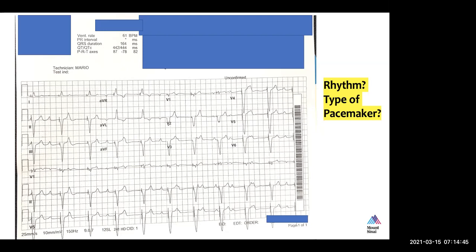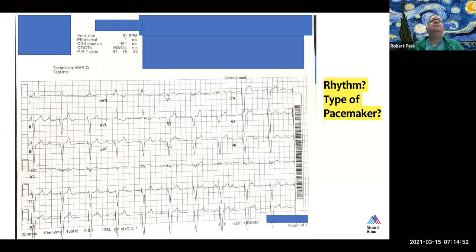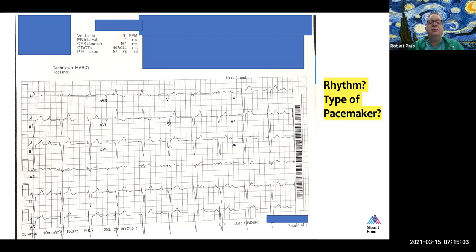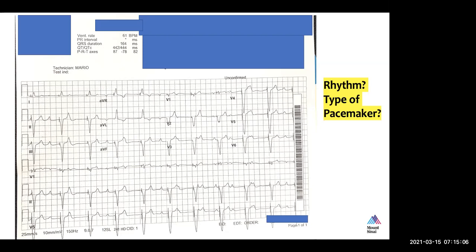I mean, if it's a newborn, I don't think we'll be able to accommodate a dual chamber pacemaker. Why do you say that? Because of the size of the baby, it's difficult to position leads in. You've never seen a baby with a dual chamber pacemaker? No, actually I have. Yes, we have babies right now who have dual chamber pacemakers. In that case, I would ask for a dual chamber.